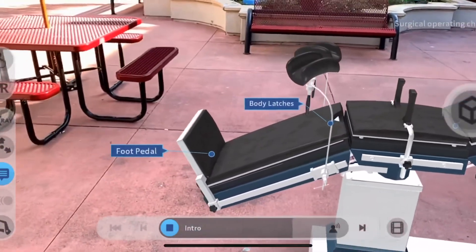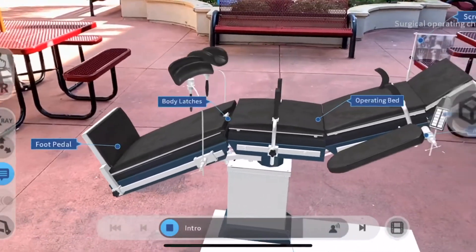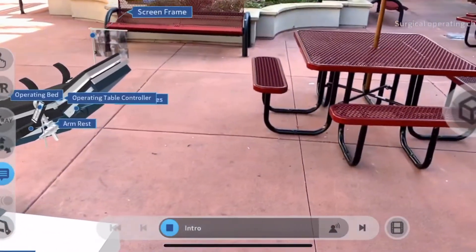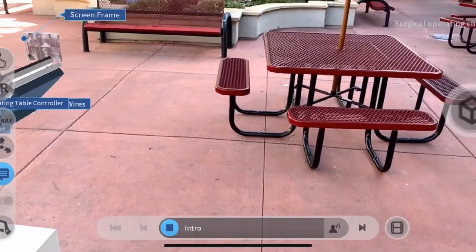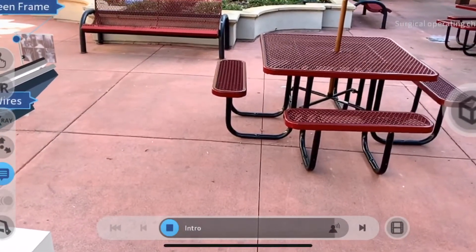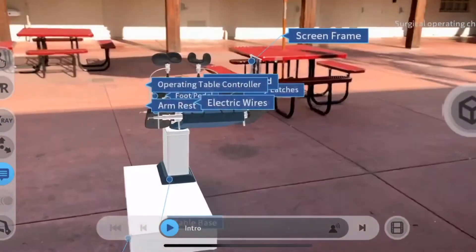The ease of use, versatility, and optimized access to the operating area has increased the working ergonomics for the surgical team. Let us explore more on its operation by clicking on the play icon, and don't forget to watch the detailed video.